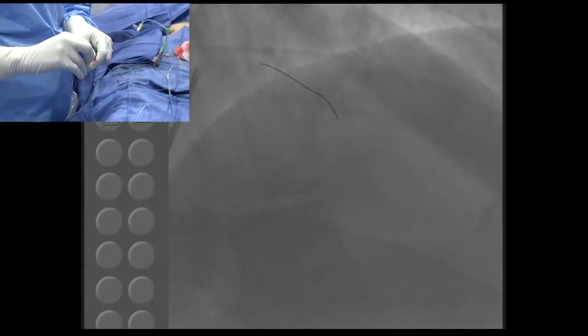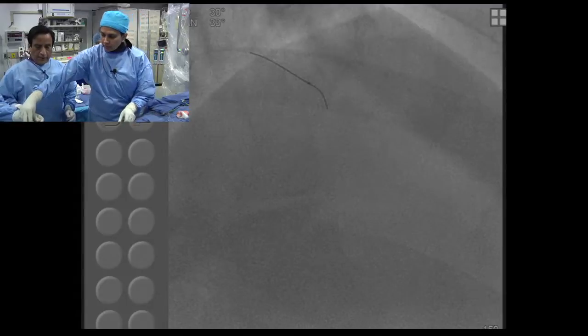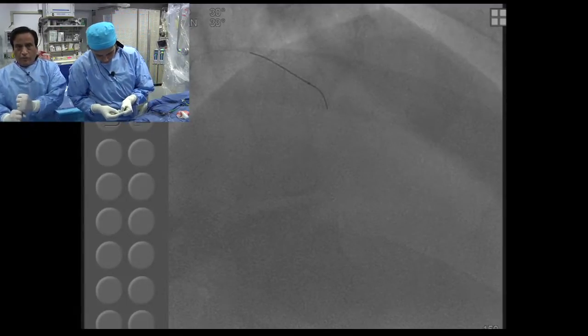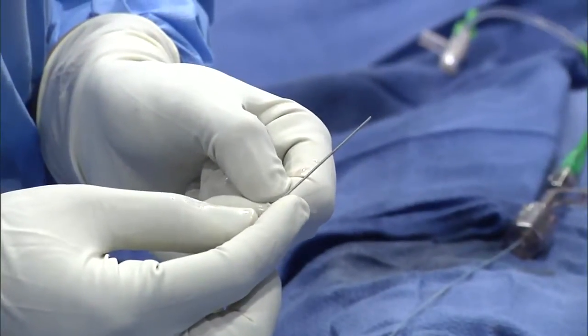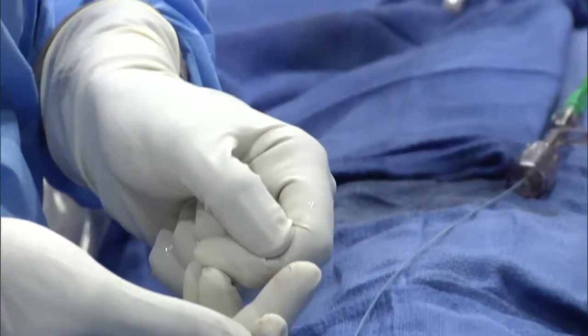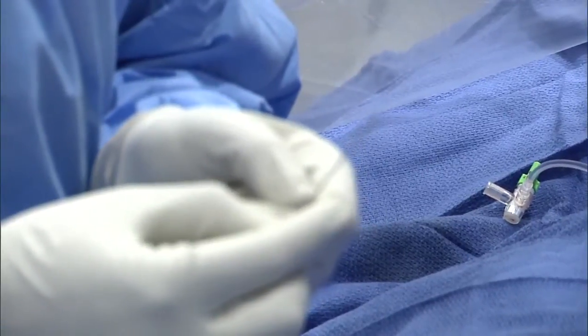Now sometimes these will rupture, though proximally you bring the balloon and then you stop, make the curve, show the curve which way you want to make it. And then what you do is proximally you occlude with the balloon. So therefore, that bleeding, rupture of that vessel causing slight bleeding stops. So I had not created any tamponade, but definitely could create a catastrophe.